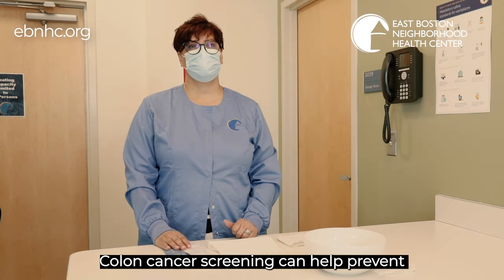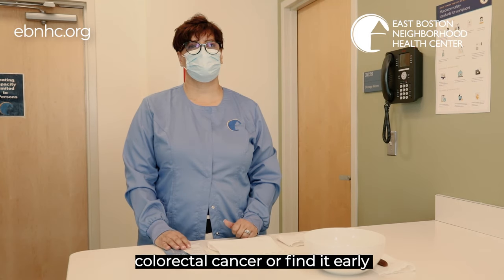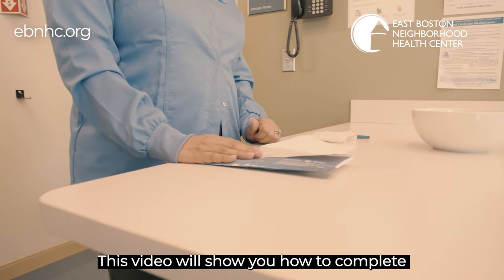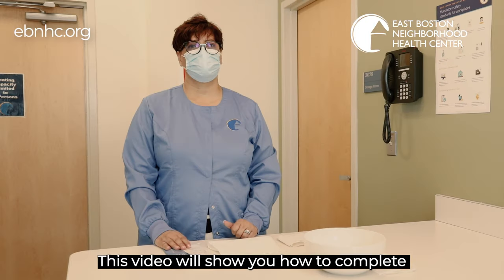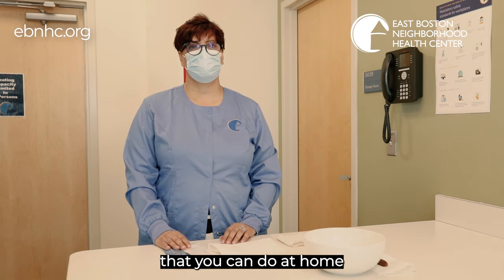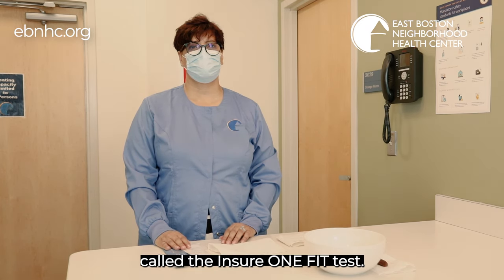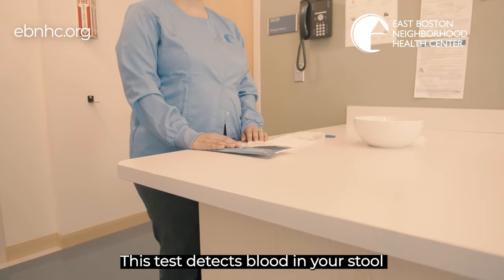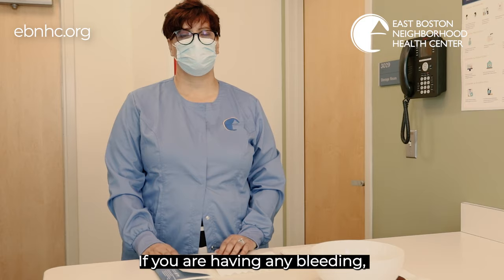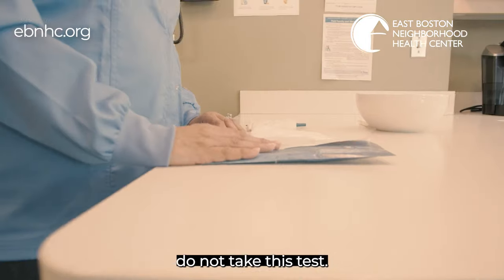Colon cancer screening can help prevent colorectal cancer or find it early when treatment works best. This video will show you how to complete a simple colon cancer screening test that you can do at home called the InSure ONE FIT test. This test detects blood in your stool or poop. If you are having any bleeding, do not take this test.